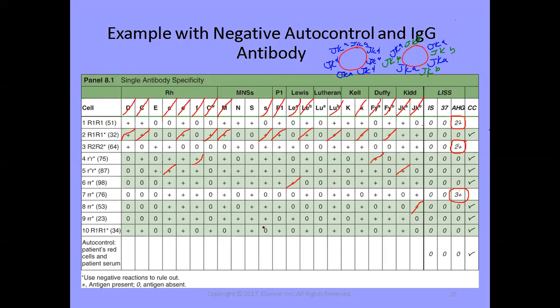Okay, now we're going to move to 9. Still can't do anything with E. Nothing with N. Nothing with big S. I'll jump over to K. Nope. Okay, nope. And then we only have one cell left. So here, nope, can't do anything with big E. We can finally get rid of N. Okay. And big S because the antitheticals aren't there, so that was good to get rid of 2 of those. Nope, no LUA, no big K. Okay, so that's basically all we can do.